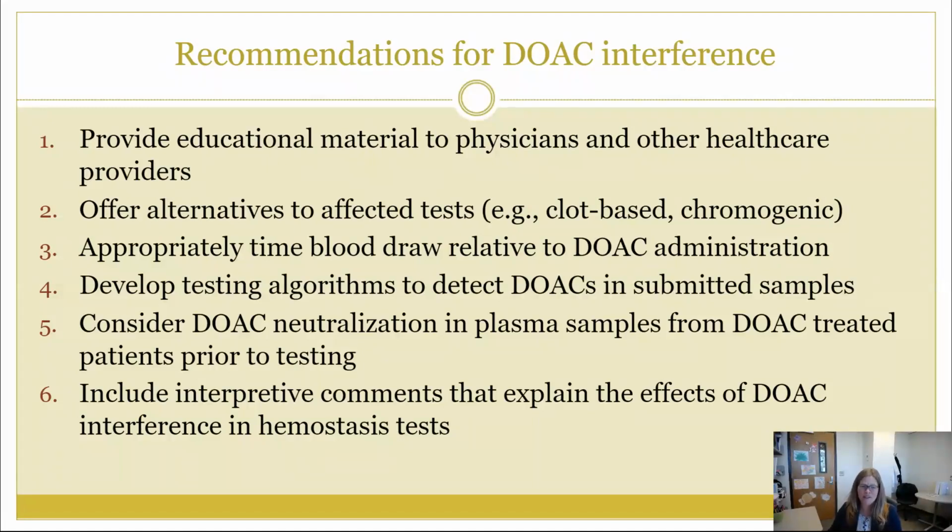And then finally, this is a lab-specific decision, but you might want to consider DOAC neutralization in plasma samples prior to testing.